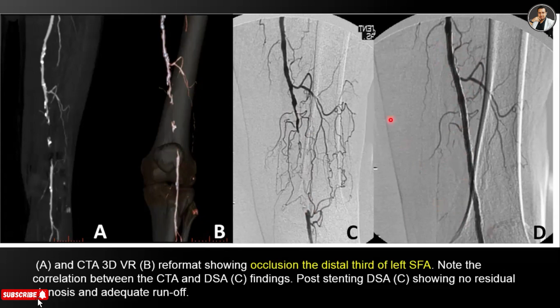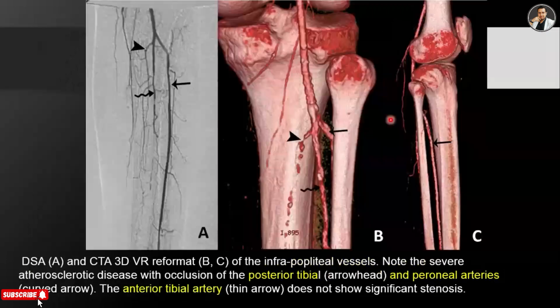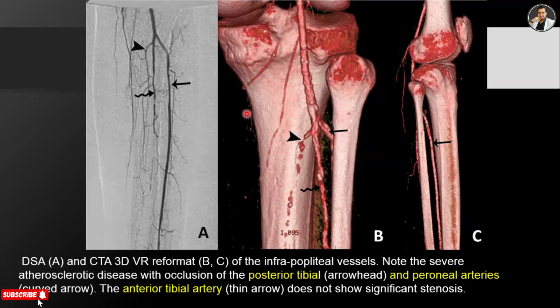So what pathology is there here? In this image, we can see DSA, digital subtraction angiography, and 3D VR reformat.